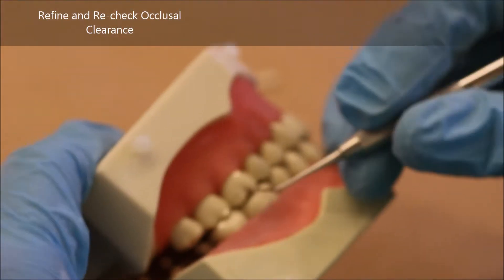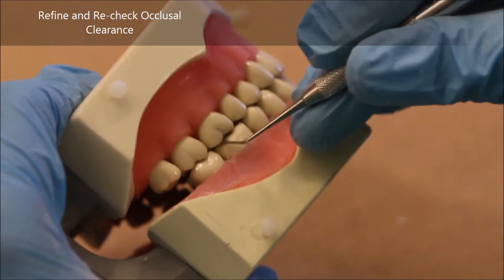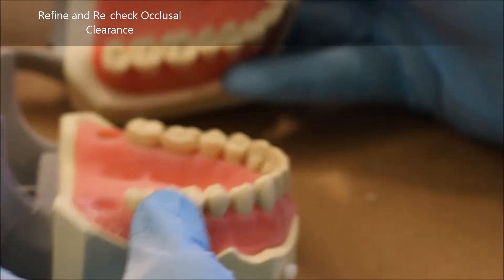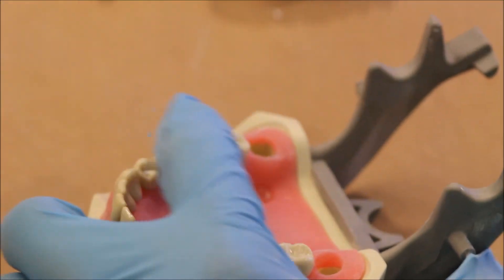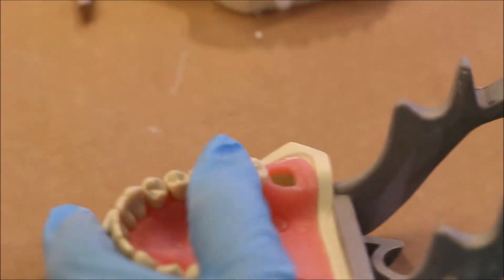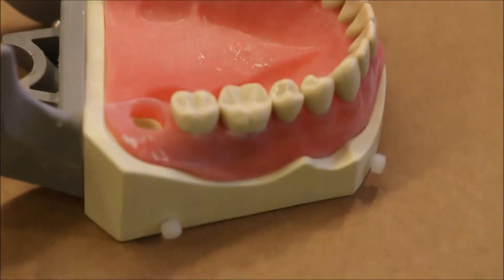Another final check — as you can see, the RGS3 goes through without catching on anything and seems fairly loose, so I'm pretty sure I've gotten my 1.5 millimeters. What I'm doing here is trying to take down any sharp points that could be potentially difficult to deal with later on or could throw off the angulation of the burr when you're trying to do the axial reduction.